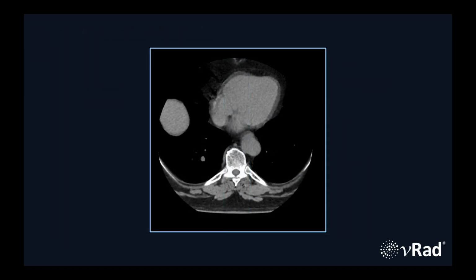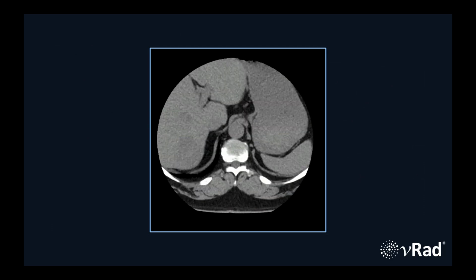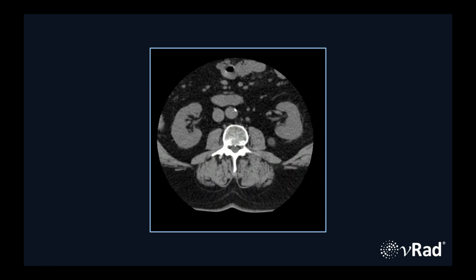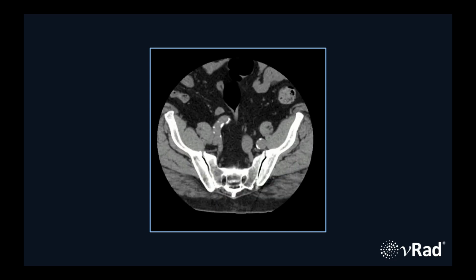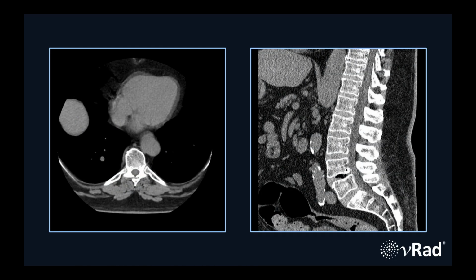Perhaps the most common submission is a corner of the film finding. Let's look at this lumbar spine CT. The indication on this lumbar spine CT was low back pain, displacement of lumbar disc with radiculopathy. So there are the axial images. Here's the sagittal reformat. You can certainly see at L4-5 there's a degenerated disc with vacuum disc phenomenon, grade 1 anterior listhesis of L4 and L5. It's straightforward to make that diagnosis. You've got directed clinical history. The examination is focused directly on the problem.